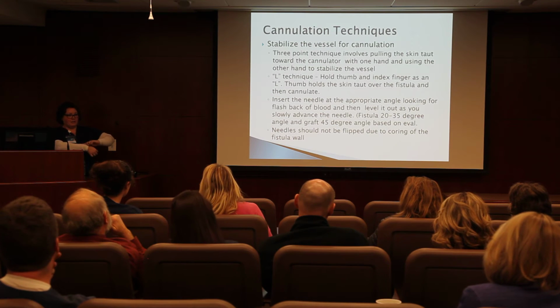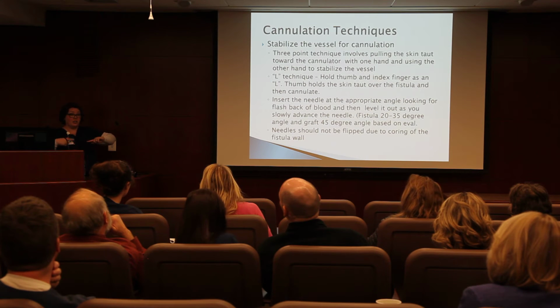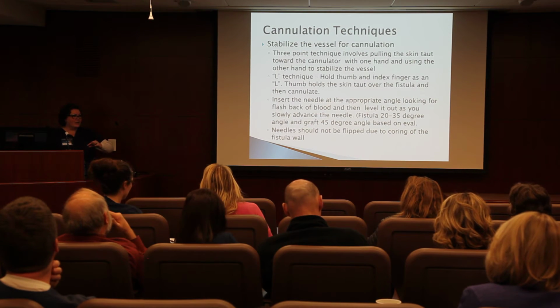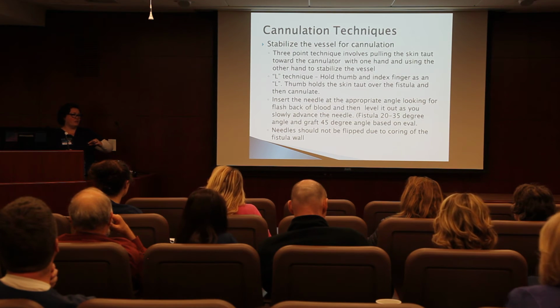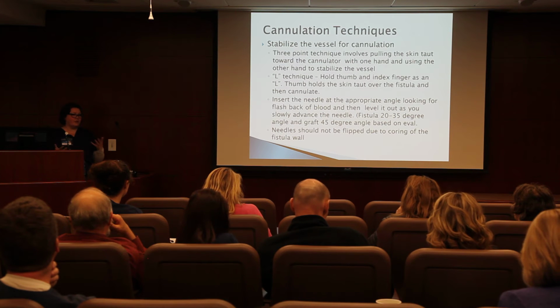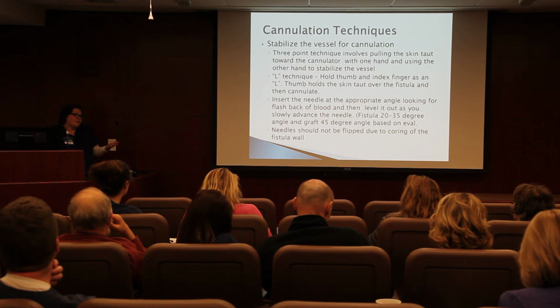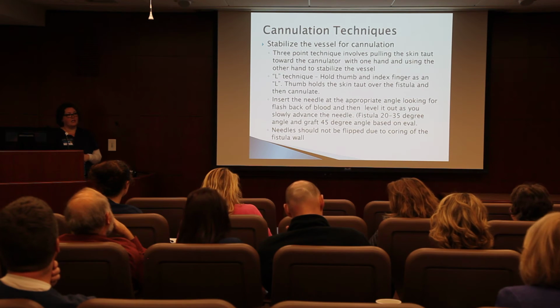I like to place my finger on the vessel where I'm actually going to go because I can feel it. Sometimes you have to use your thumb and finger to stabilize it and go in. Everybody's different. We do have arms downstairs or over in the dialysis unit. If anybody wants to come down, call me and try to stick an arm. It's different than a real fistula, but it gives you some play with your different techniques.